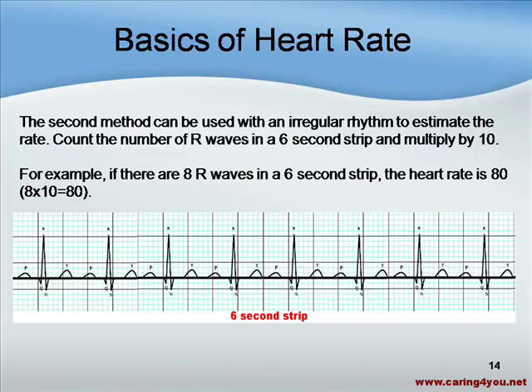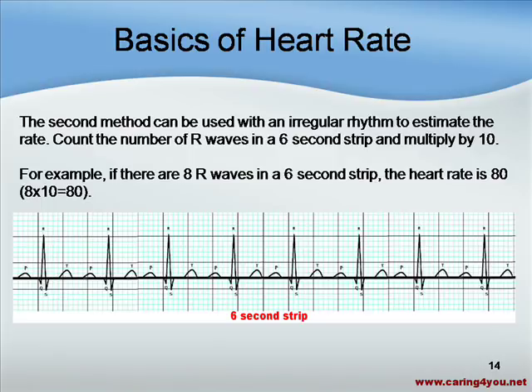When the rhythm of the heart is irregular, we use the 6-second method to estimate the rate. To figure it out, you count the R-to-R intervals in a 6-second strip and then multiply by 10. In this example, there are 8 R intervals. We take the 8, multiply it by 10, and arrive at an estimated 80 beats per minute. Both of these methods are just estimations.